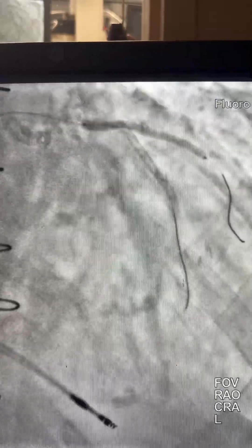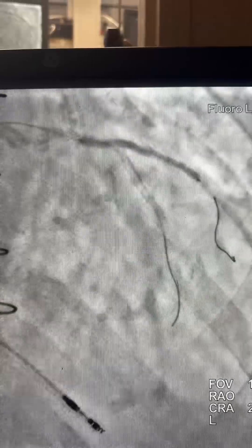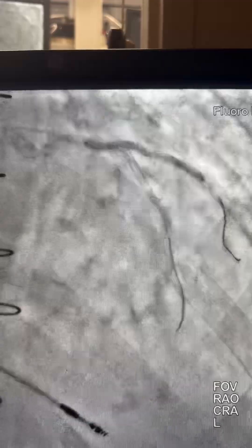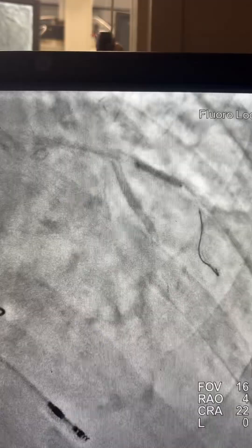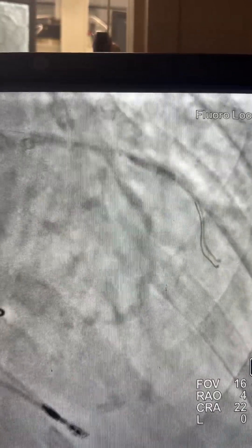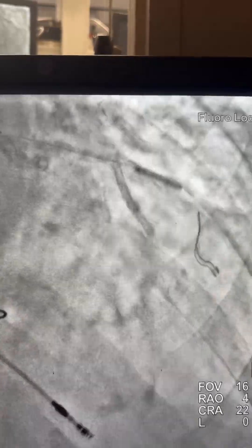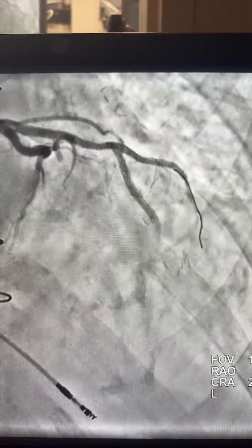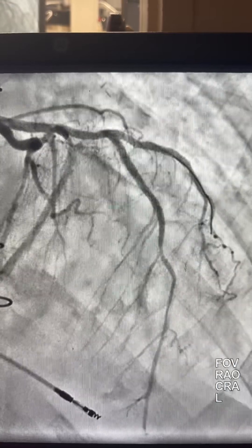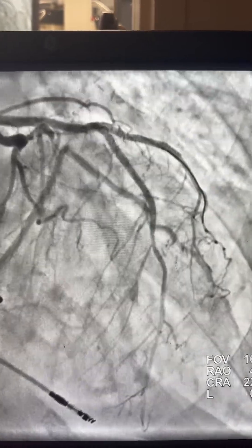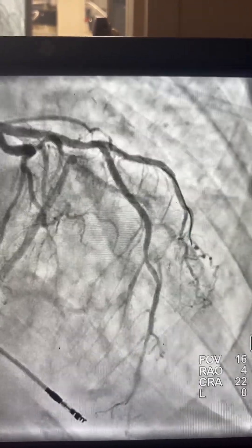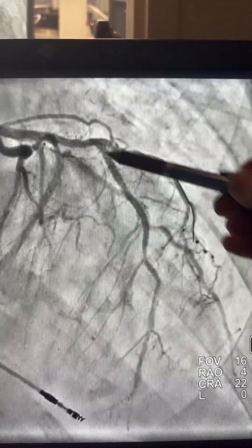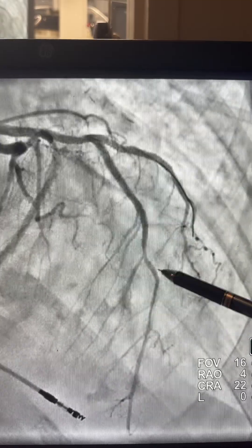Here is the stent toward the large diagonal — a 2.5 stent, post-dilated using a 2.75 NC balloon. Here is the flow after: we have nice flow toward that large diagonal and the LAD.